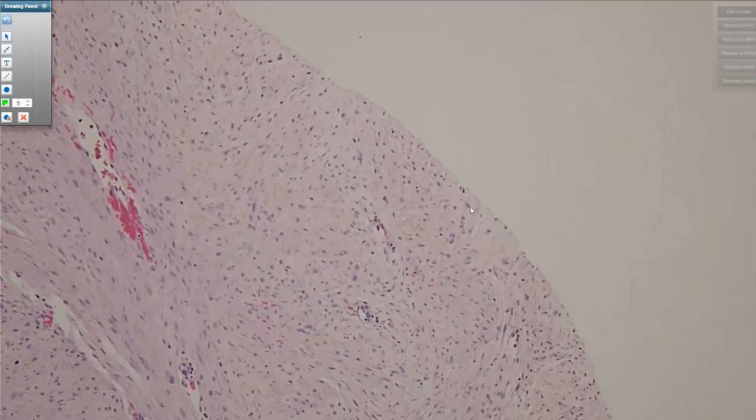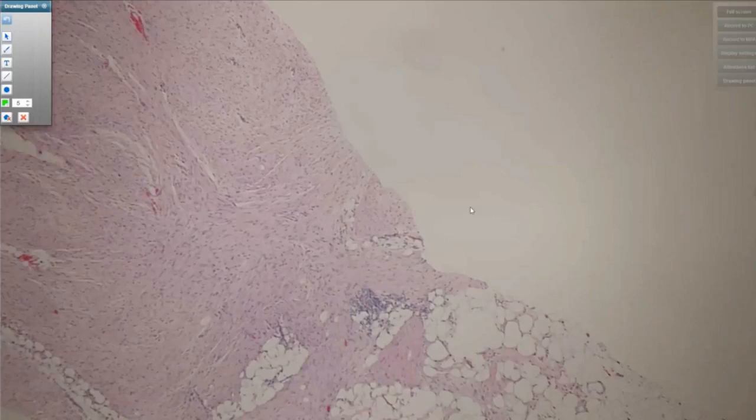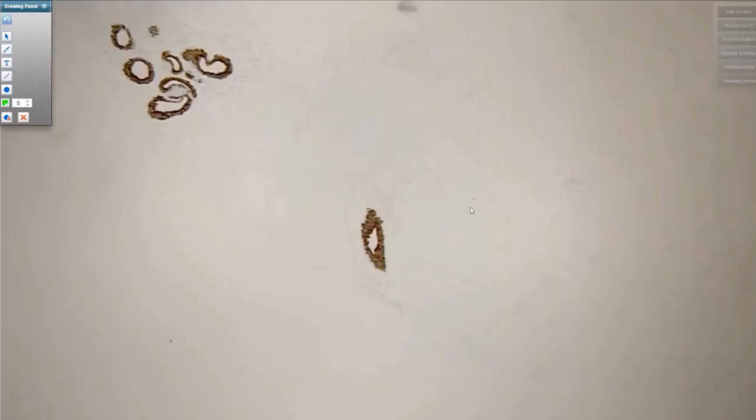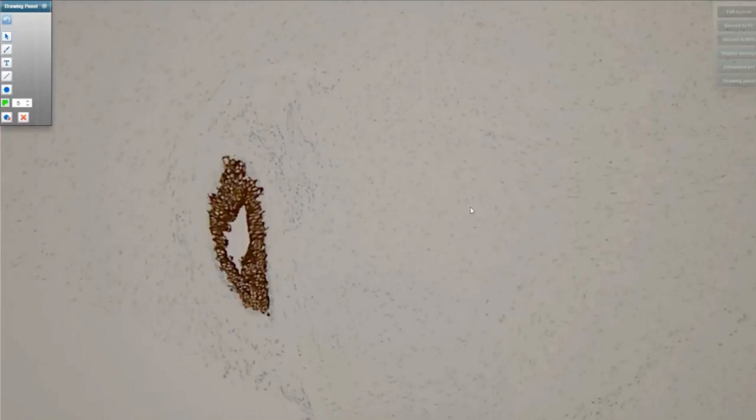So as another feature I might mention as I'm here, in fibromatosis, you sometimes see these lymphoid aggregates. Now, fibromatosis in the breast, as I said, will be negative for cytokeratin. So this is an example of one. This is CAM 5.2. You nicely see the ductal epithelial cells labeling, and although pale in the contrast here, the lesional cells are negative for keratins.